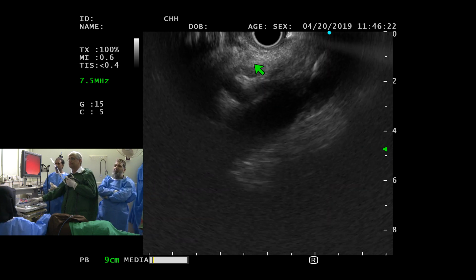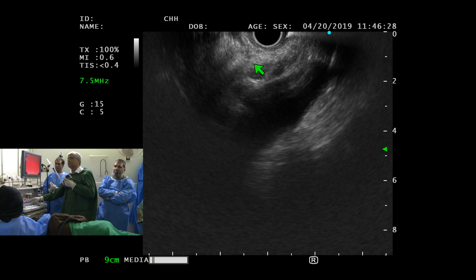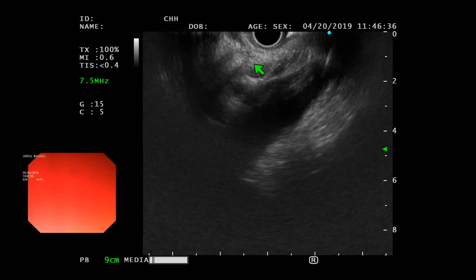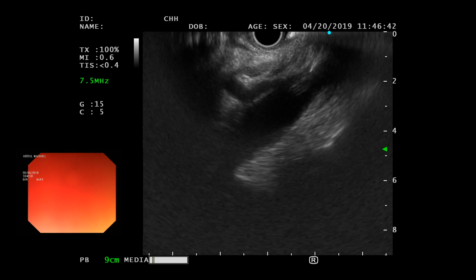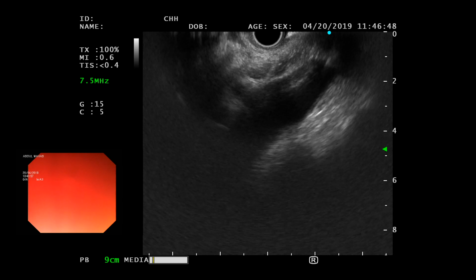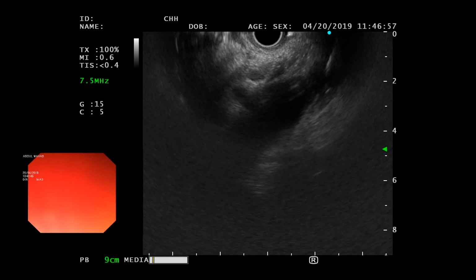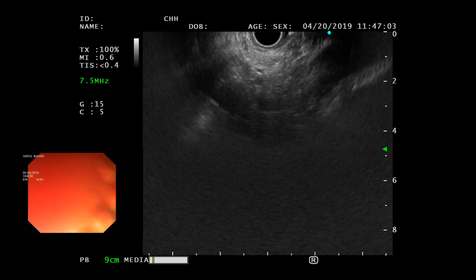What I do is usually take a look at the window. If it's a really skinny person, and you don't have much fat in there, then I would go with the 22 gauge needle. Also, be careful when you're looking at the area right above the celiac artery. This looks like a nice ganglion. A ganglion can be 1 centimeter, 1.5 centimeter sometimes too. But just make sure it's not the left adrenal gland, which could be in the vicinity as well. So just look around and make sure that the adrenal gland is somewhere else. Let me show you the adrenal gland, if I can.